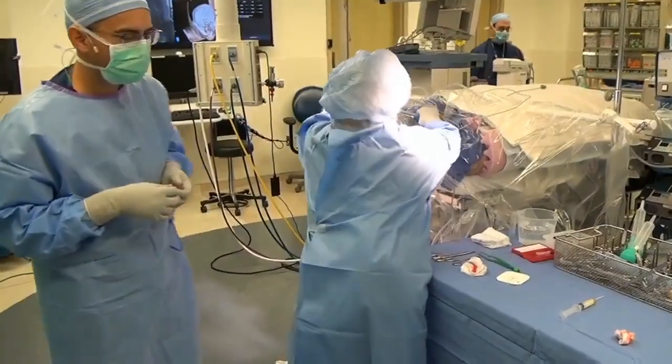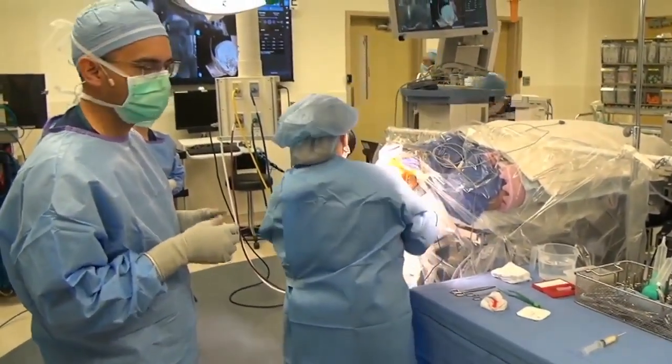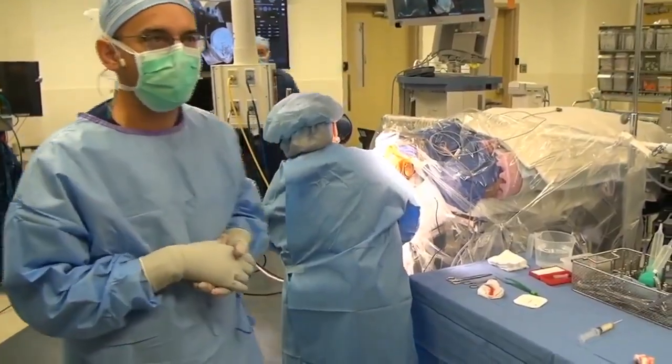All right. So that's the operation. We're going to undrape, and then he's going to get extubated and go to recovery. Do we have any other questions?